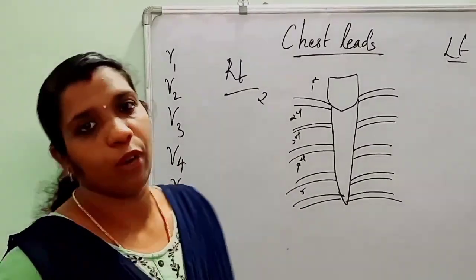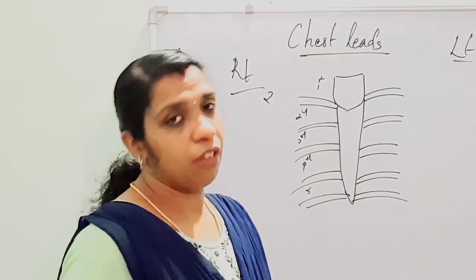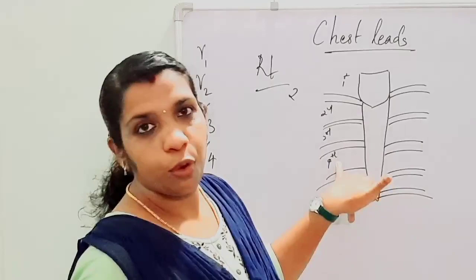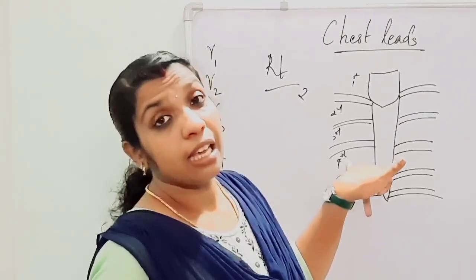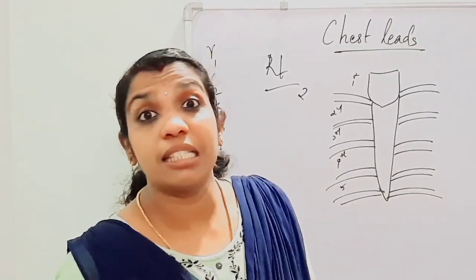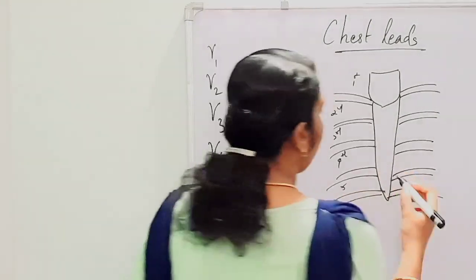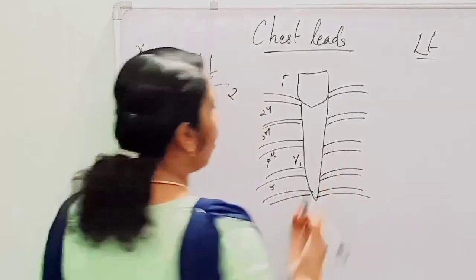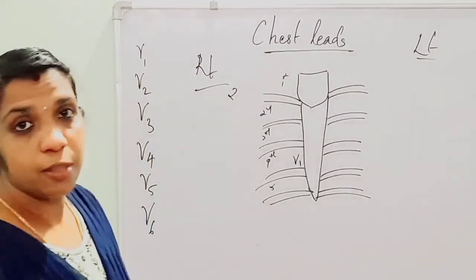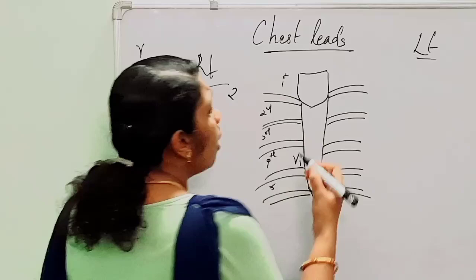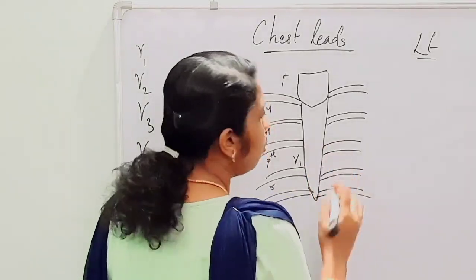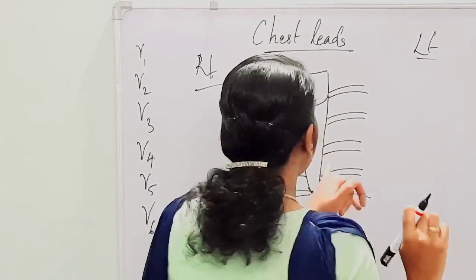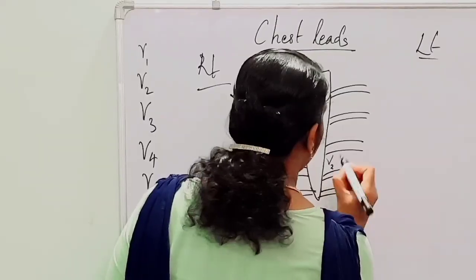The first lead is V1. The lead V1 is placed in the fourth intercostal space near the right sternal border. So we will be keeping V1 here. Next is V2. V2 is placed in the fourth intercostal space at the left sternal border.